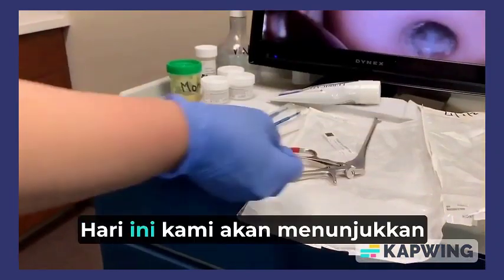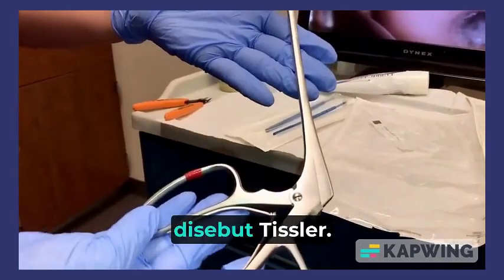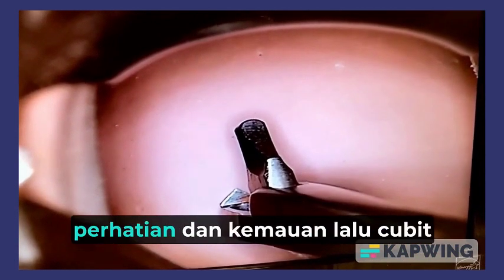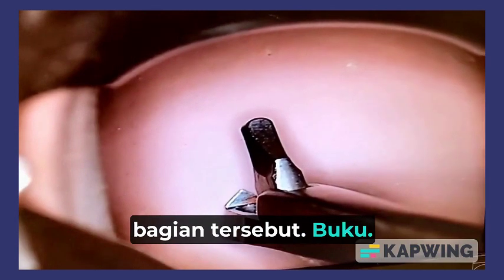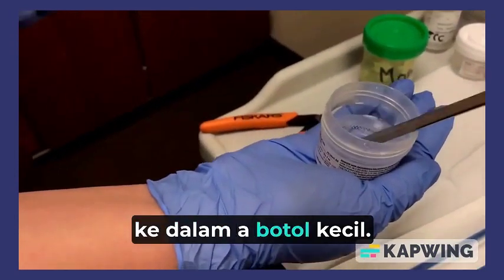Today we will be showing you both methods for collecting the biopsy. This instrument here is called the Tischler. This instrument here will be placed on the areas of concern and will then pinch off that part of the cervix. After the specimen has been collected, it will be then placed into a vial.